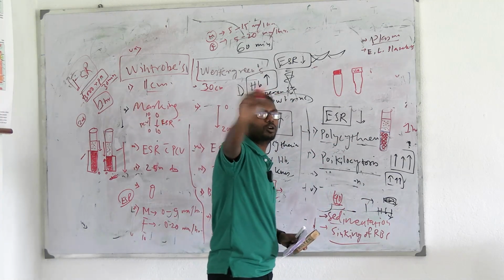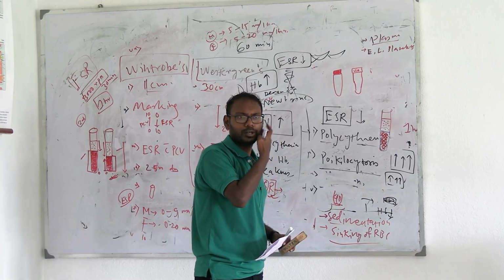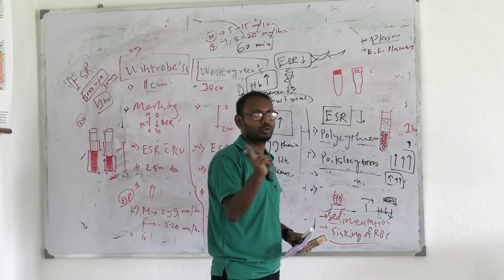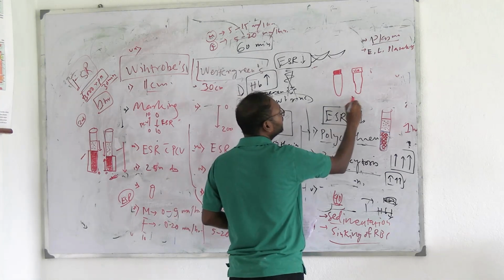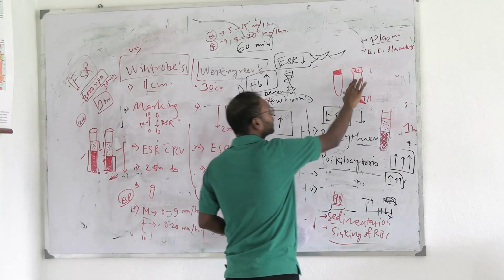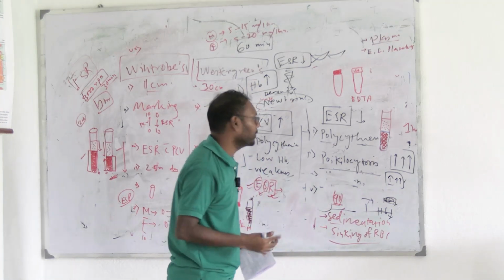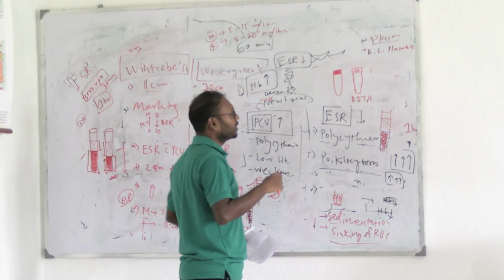ল্যাবে যে ভায়োলেট টপ টিউব গুলো ইউজ করা হয়েছিল, তো কি যেন নাম ওই মেয়েটা ছিল, আজিজা ম্যাম তোমাদেরকে দিত পরীক্ষার জন্য। ওকে, সো ইউর ব্লাড ওয়াজ স্টোরড। নাও ইফ ইউ রিমেম্বার, ইফ দ্য ব্লাড ওয়াজ ক্লটেড, নো, তার মানে কি ওর মধ্যে অ্যান্টিকোয়াগুলেন্ট দেওয়া থাকতো। দিস অ্যান্টিকোয়াগুলেন্ট ইজ কল্ড EDTA। ঠিক আছে? Now these violet top tubes are actually used to measure almost all of the blood parameters. Okay, like CBC, complete blood count এর ক্ষেত্রে এটা ইউজ হয়। Why?